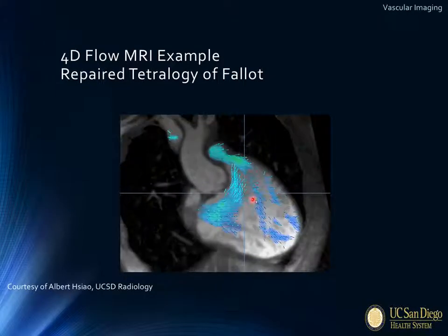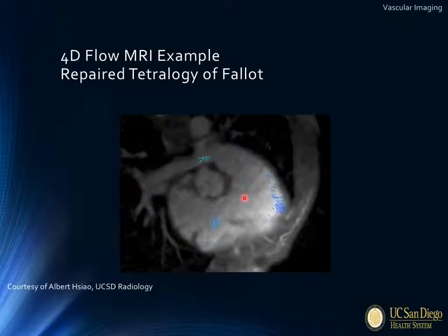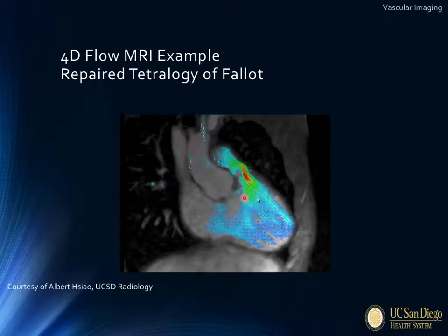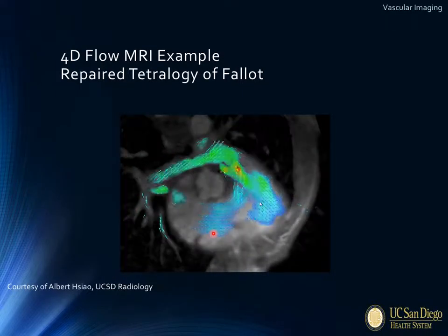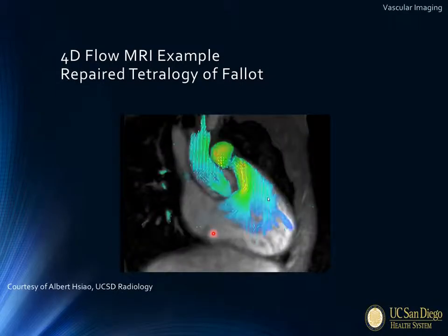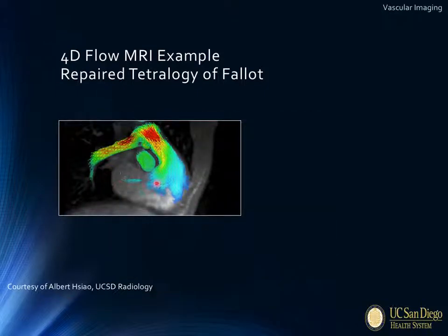And you can plot the velocity of the blood and the direction of that flow, superimposed on top of the magnitude images, which is very powerful in hearts that have very strange geometry and orientation. And so here's an example of a mitral leak, like a jet, a tricuspid regurgitation jet right here, that's obtained in a location that is really hard to capture, say on echo or some other acquisition.